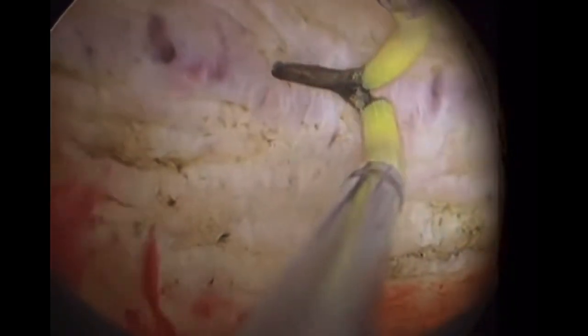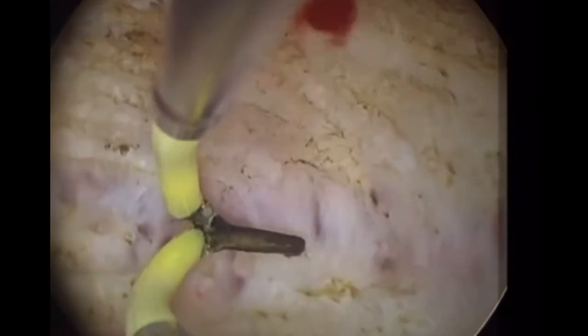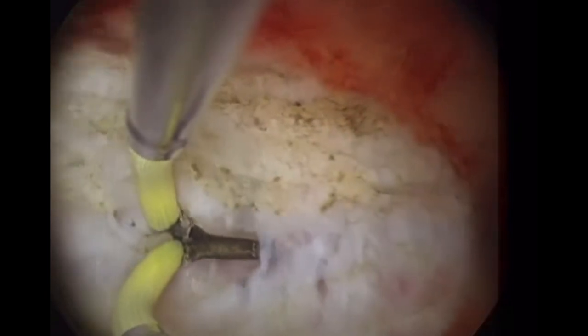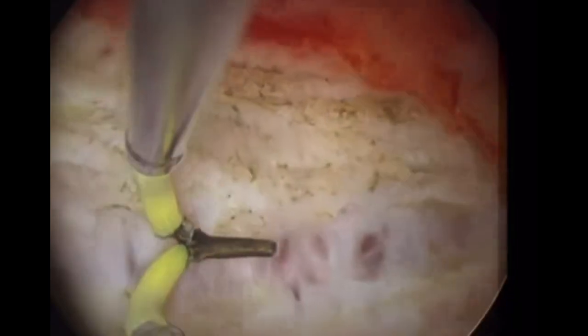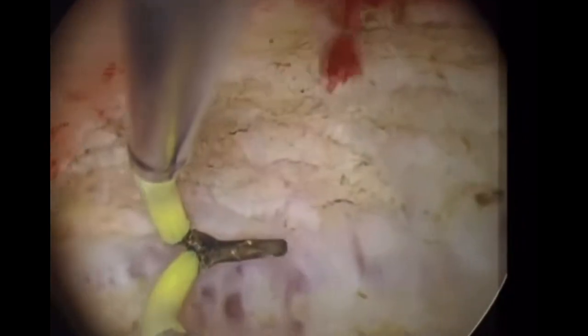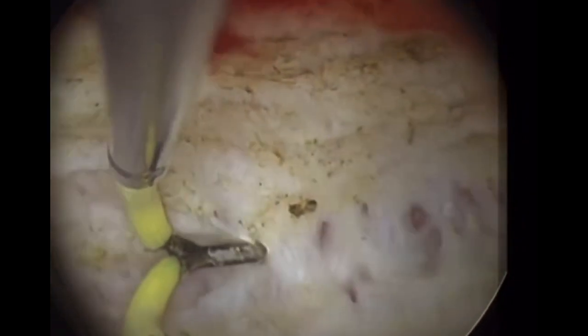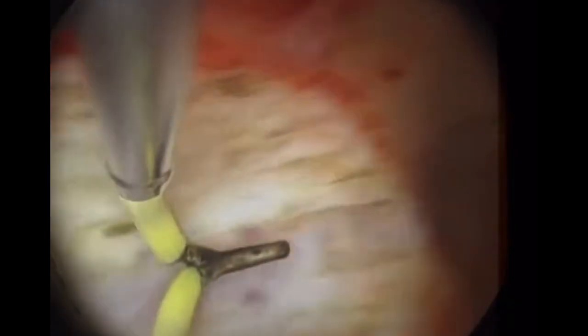Just touch the tissues — don't cut. Give a chance for spontaneous retraction. Now here is the secret: the cutting element in this surgery is not the monopolar electrode. The cutting element is the fluid pressure. Just give a lead to the cut by making a small touch, and then the fluid pressure will continue cutting into the proper plane, into the path of least resistance. By this, you guarantee that you are exactly in the middle.